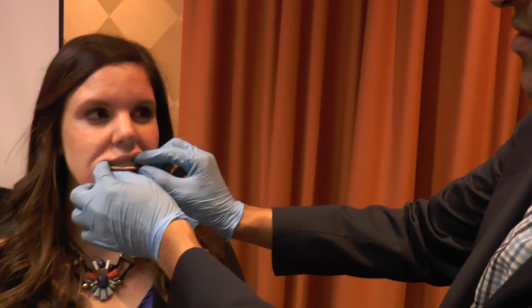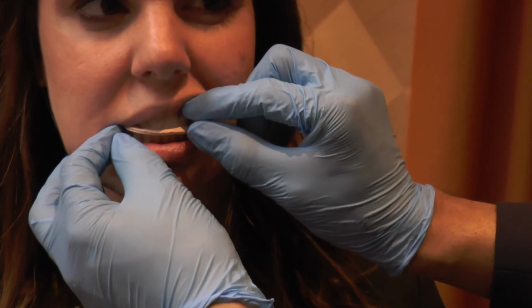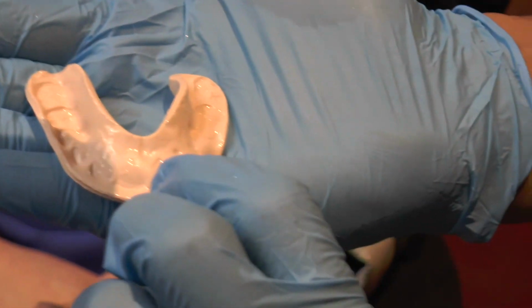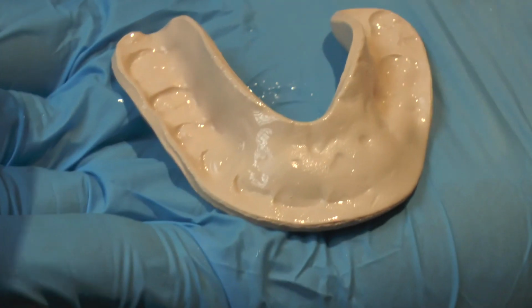So to check if it's time, I want you to just push up against it, and if you can't indent it, then it's time for you to remove the device. Go ahead and open that for me. And what you'll see here is you'll get good indentations of your patient's dentition, the upper arch and the lower arch, in their habitual bite, which will give the patient the ability to know where to put their bite the next morning.